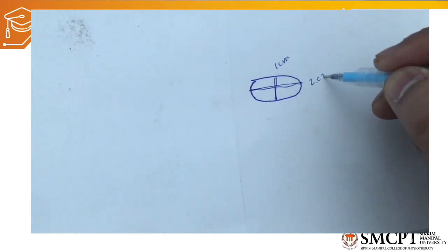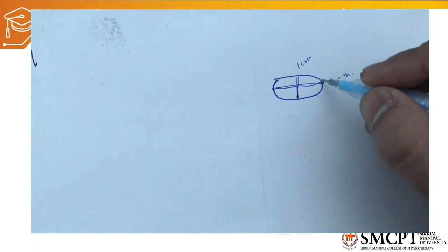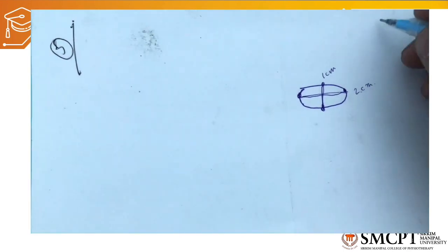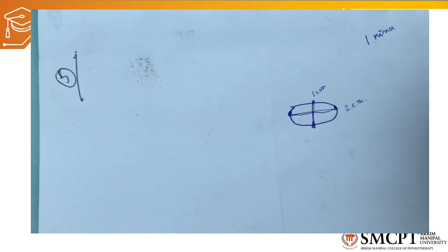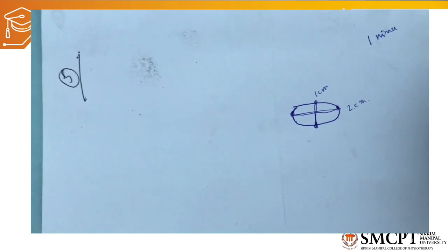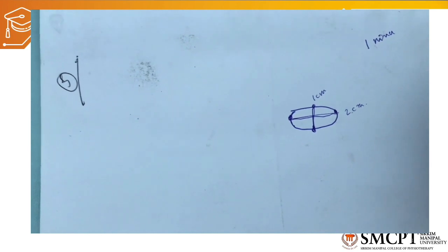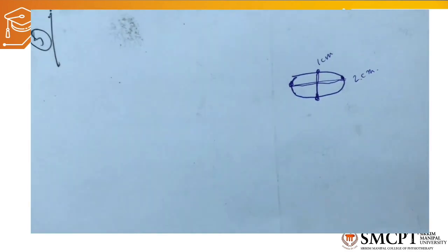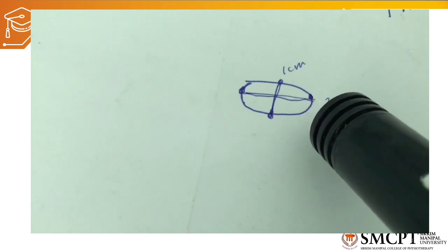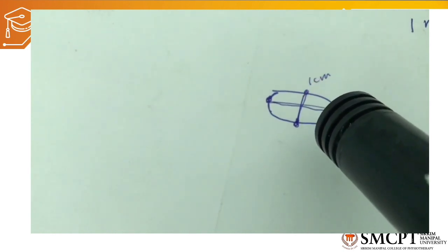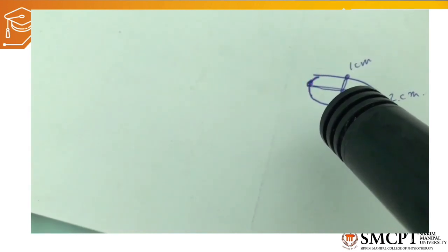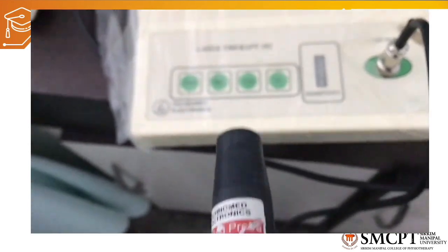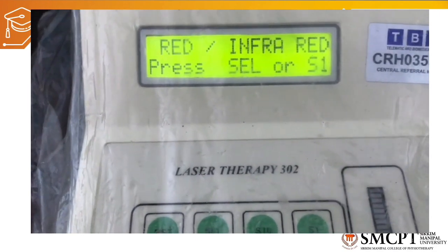To treat a tissue area of 1 by 2 centimeters, we divide the tissue into 4 points where the laser beam will be applied. If the calculated treatment time is 1 minute and we have 4 points, we divide 1 minute by 4 to get 15 seconds per point. We apply laser therapy at each point — 0.1, 0.2, 0.3, and 0.4 — for 15 seconds each, resulting in biostimulation and new tissue growth from the wound periphery.